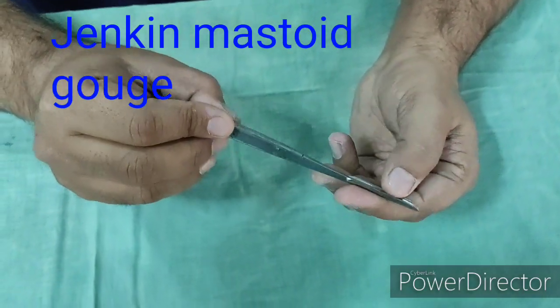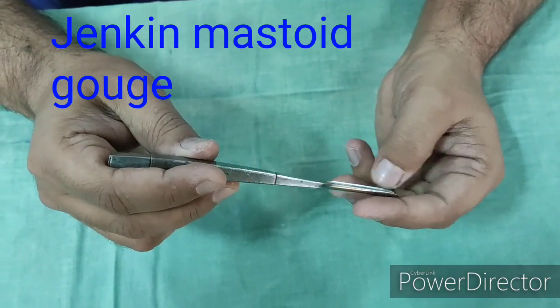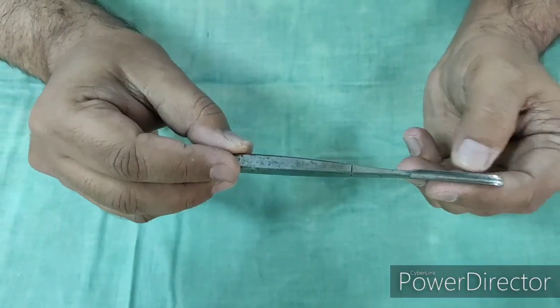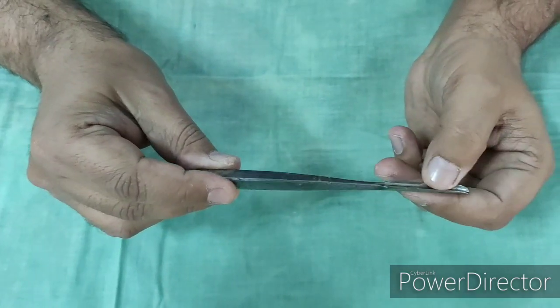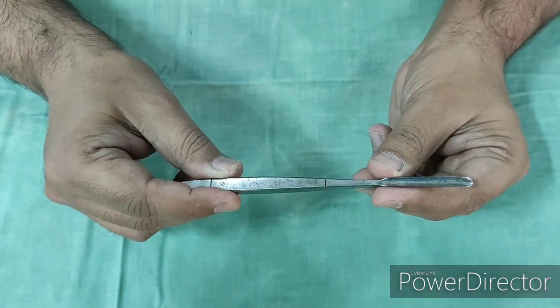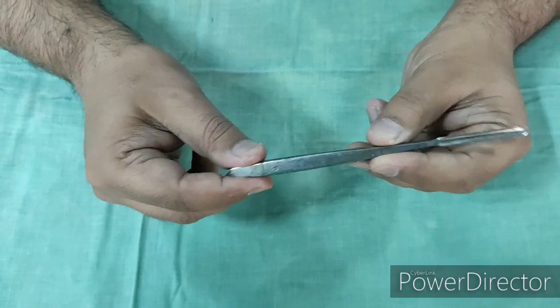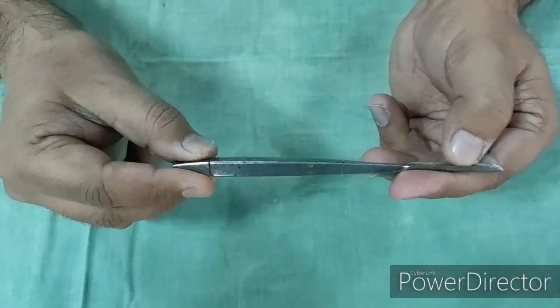This is a Jenkins Gouge. In earlier days, during mastoidectomy, the bone over the mastoid cortex was removed using this gouge along with a hammer or mallet. But nowadays this instrument is no longer used — a micromotor drill is used to perform mastoidectomy. Other uses of this instrument include removal of bone during caldwell-luc surgery and sometimes at the maxillary crest in nasal surgery. However, for the nose there is a separate instrument, which is Kilian's gouge, which is bayonet-shaped.